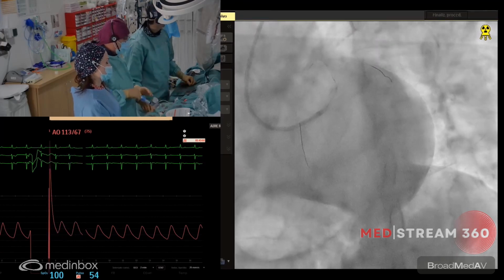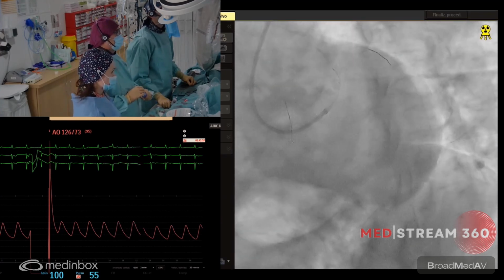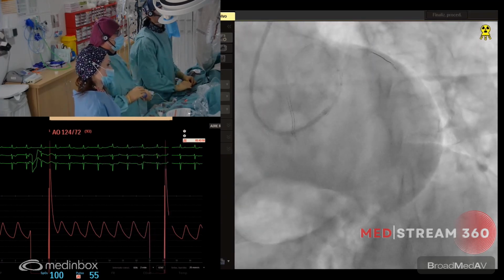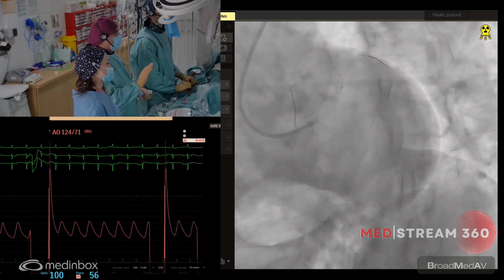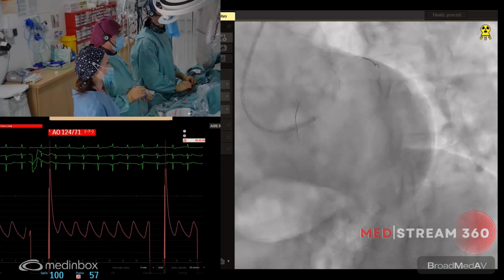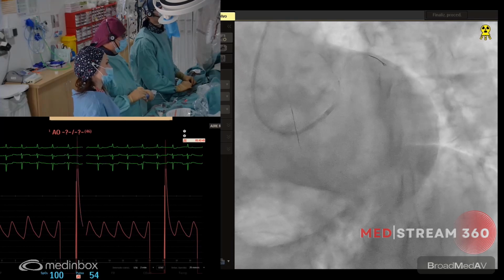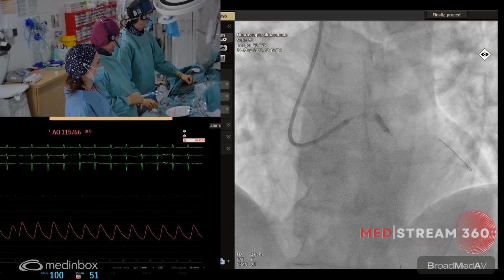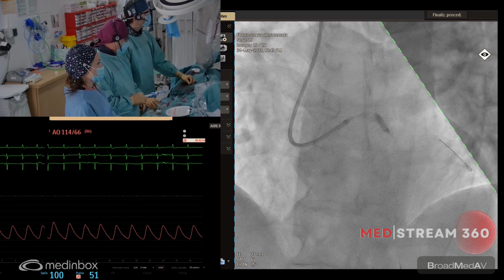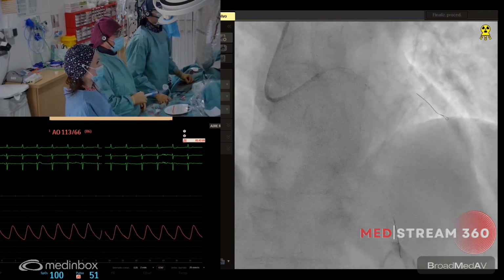Advance, wait a minute, just to be sure not entering in the left main. Test, please. Probably a little bit more distal. Test. Okay, there. Okay, up. Let's check how is everything, also the side branches and the side stenting, no?